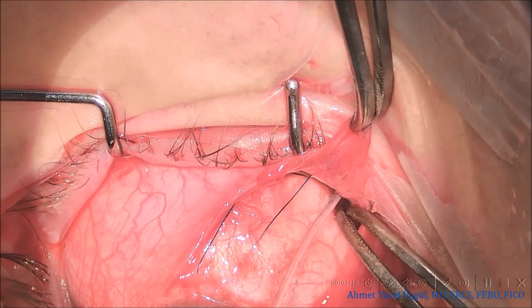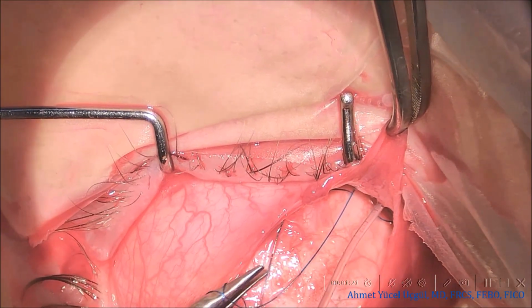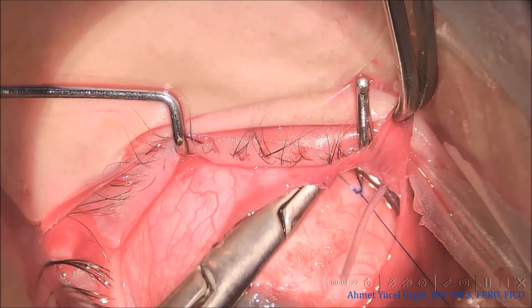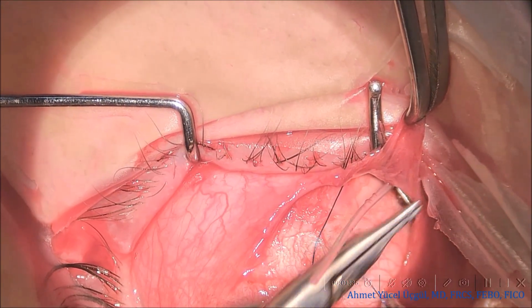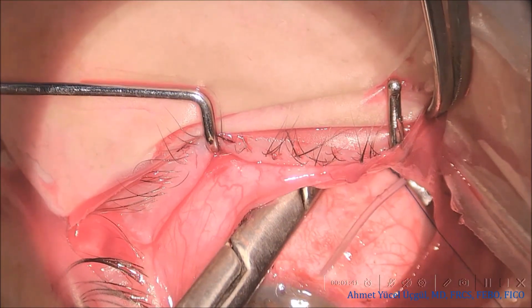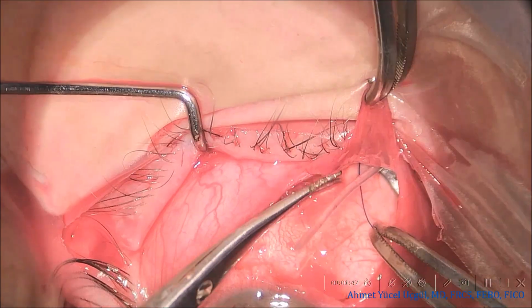In addition, the horizontal mattress configuration provides broader apposition of the plate to the globe, allowing the implant to conform more closely to the scleral surface. I tie the knot beneath the plate, which also helps reduce the risk of postoperative suture erosion. While handling the Ahmed glaucoma valve at this step, I make sure not to grasp the valve body directly. Protecting the valve mechanism is important because any inadvertent damage may affect its proper function.